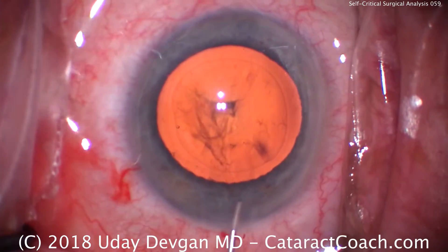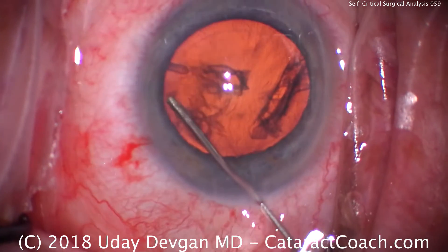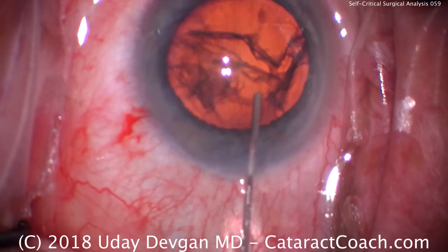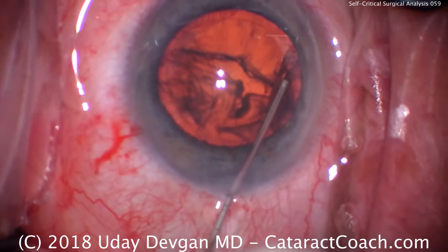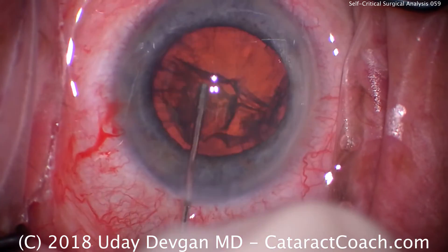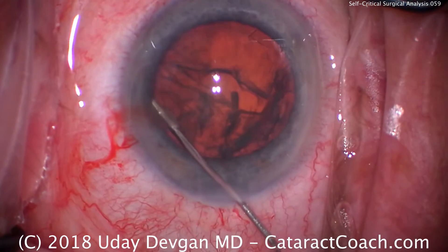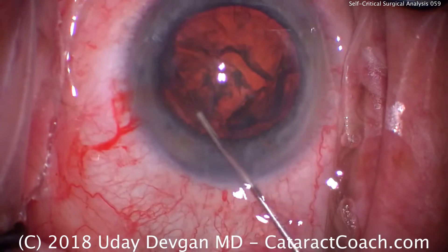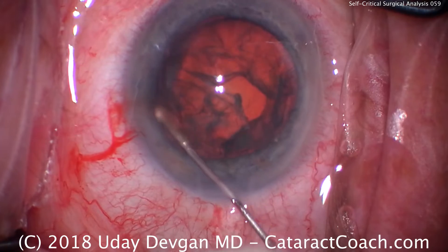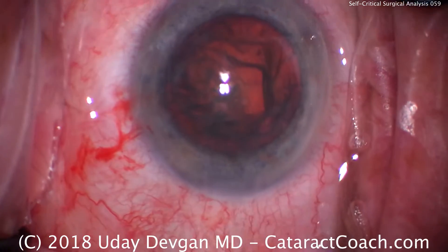Time for some hydrodissection. Advance the cannula now. Is this good hydrodissection? I think we got some hydrodelineation — not so much hydrodissection, and that may come back to cause an issue later. Not really rotating. A little more dissection here with the fluid. And it slightly prolapses out of the bag. Now it rotates.